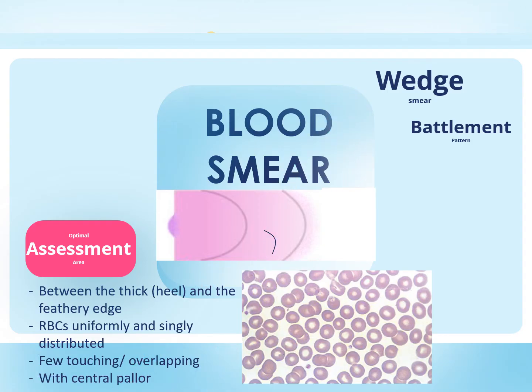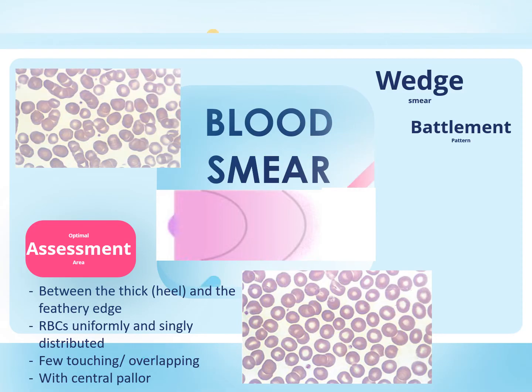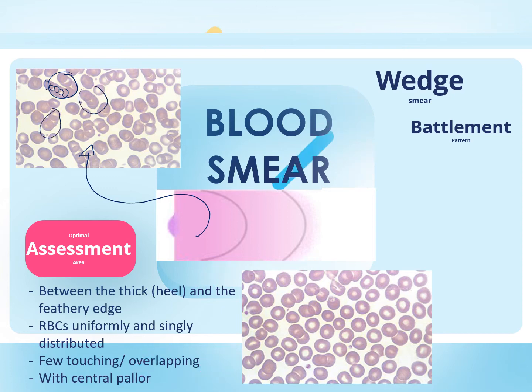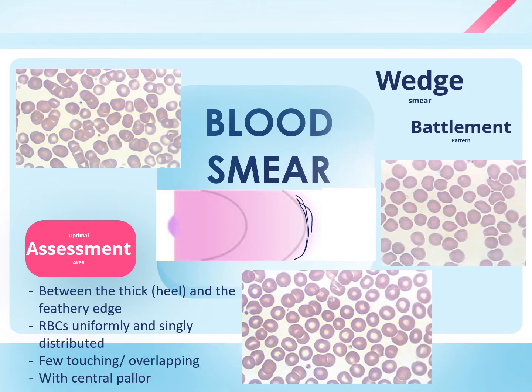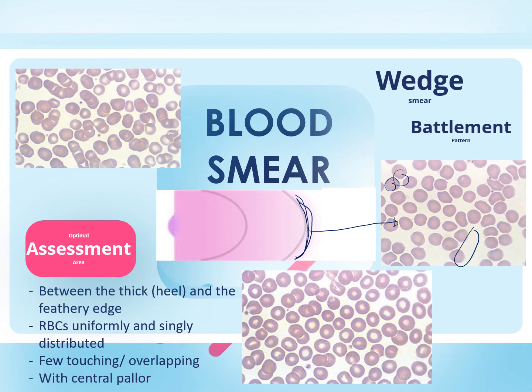Another characteristic of a good area is that the red blood cells still contain the central pallor and their shape is intact. In the thick part of the smear, we cannot perform a differential count because red blood cells pile up on top of each other forming rouleaux, causing distortions on cells including white blood cells, making classification difficult and evaluation inaccurate. At the feathery edge, the film has holes and RBCs appear flat, large, and distorted without the central pallor.